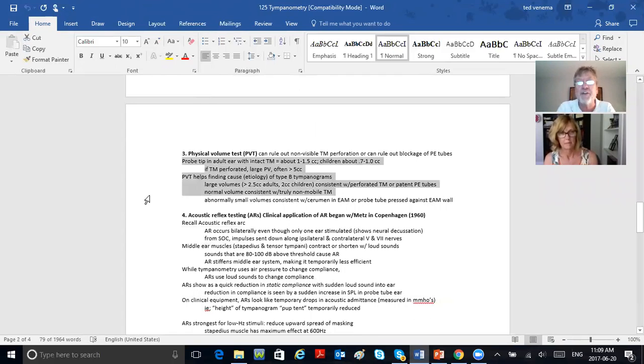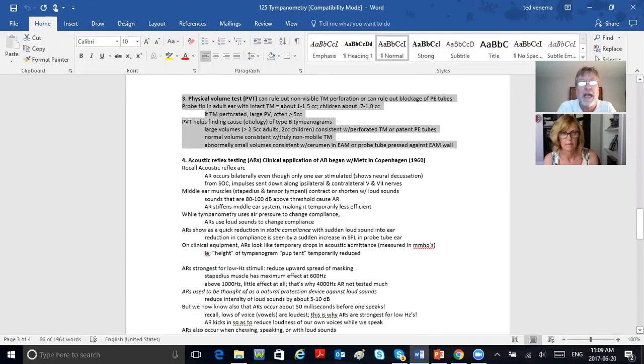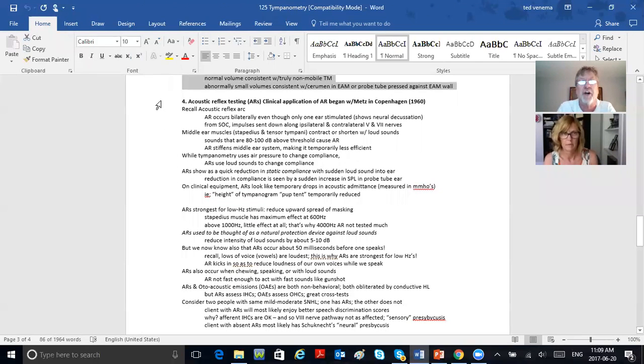Scrolling on down, physical volume test. Well, we covered that too. It's all what we did today. And now acoustic reflex testing gets into way too much detail, so don't freak out.